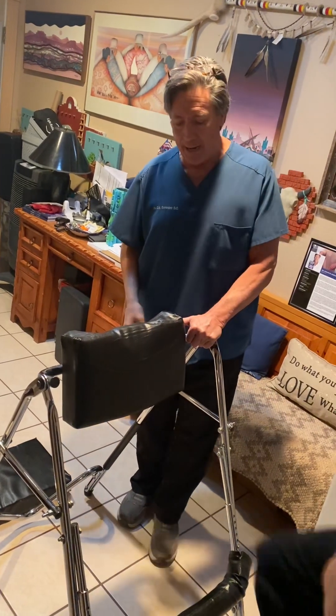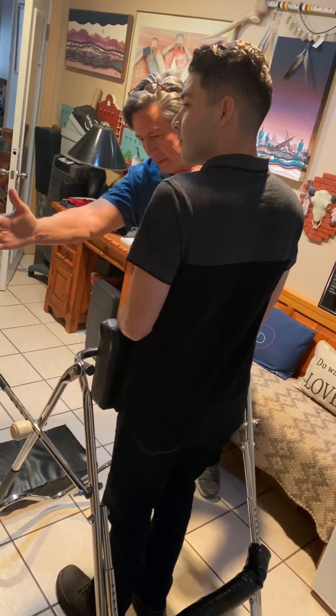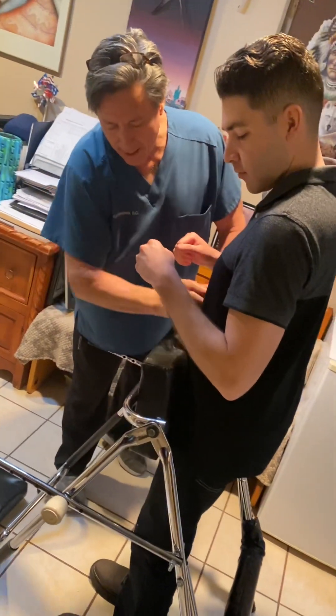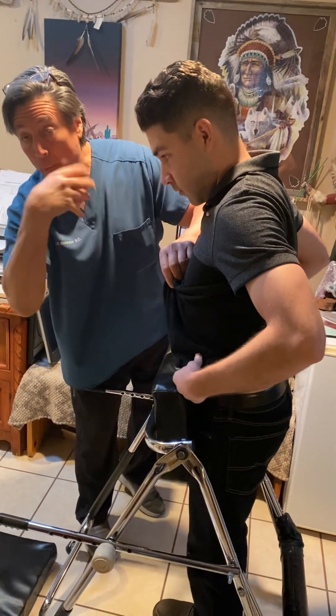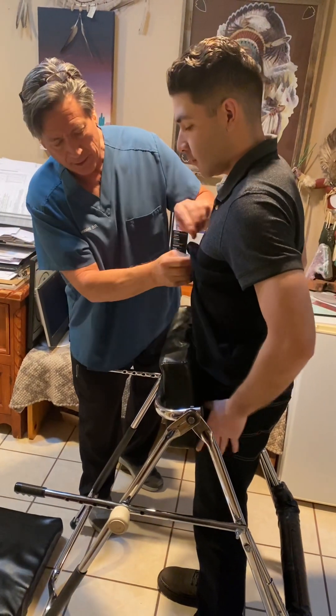Step inside, Eric. Walk up to the pad. We want to get the waist up here. We're going to pull up the shirt a little bit to give some room, so when it flips over it's not pulling and tight and uncomfortable. So we give it a little bit of room.